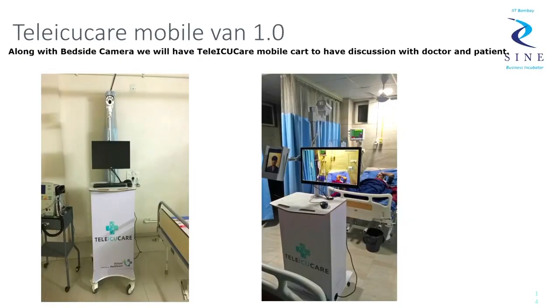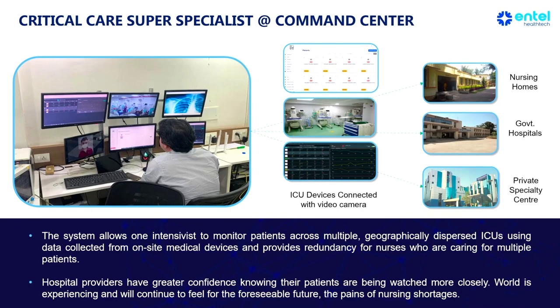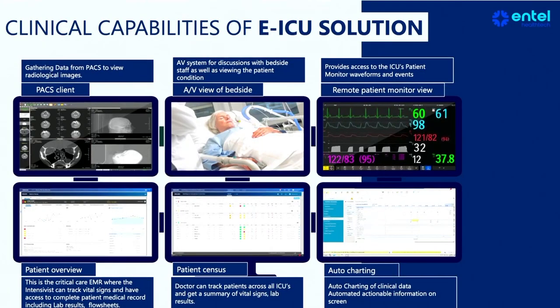This is our cart, which was installed at one of our tele-ICUs. This is our command center, where there is a 6-screen setup. With 6 screens, we are able to manage at least 100 beds. We have two persons at a time in the command center, 24/7. These are the 6 dedicated screens.